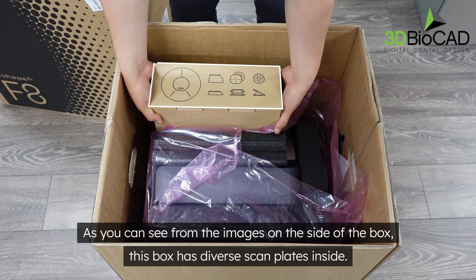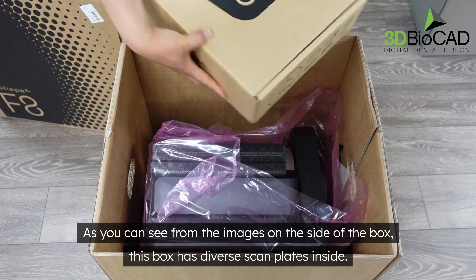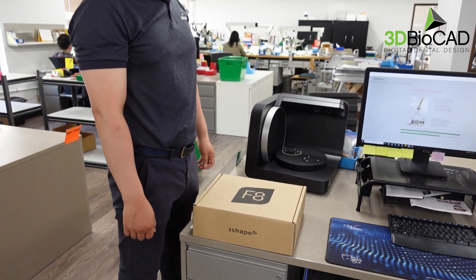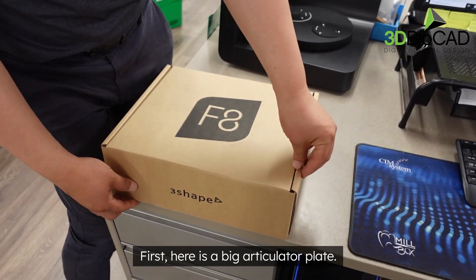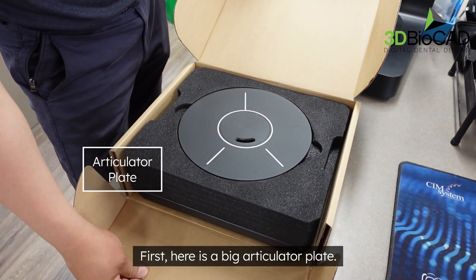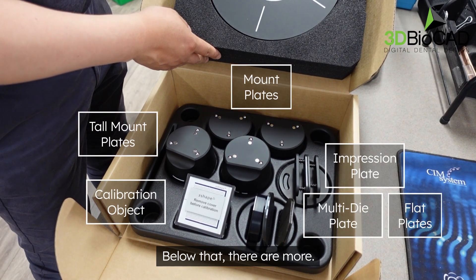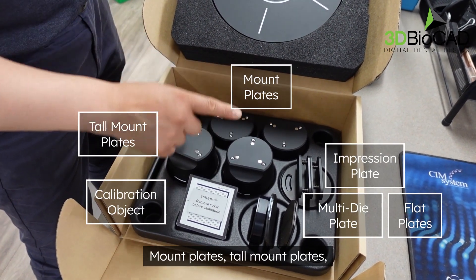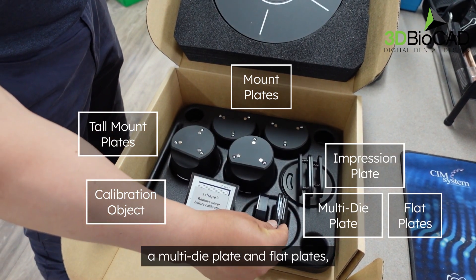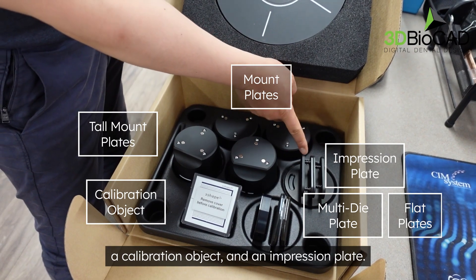As you can see from the images on the side of the box, this box has diverse scan plates inside. First, here is a big articulator plate. Below that there are more: mount plates, tall mount plates, a multi-die plate, flat plates, a calibration object, and an impression plate.